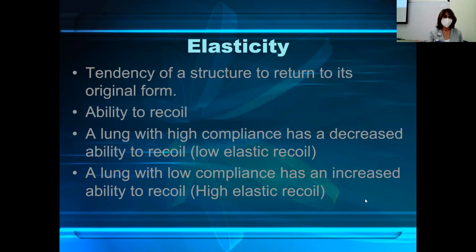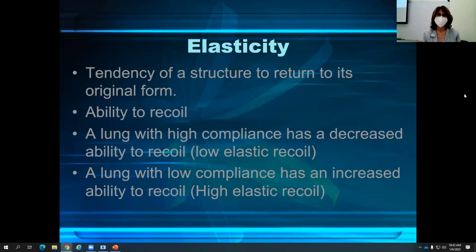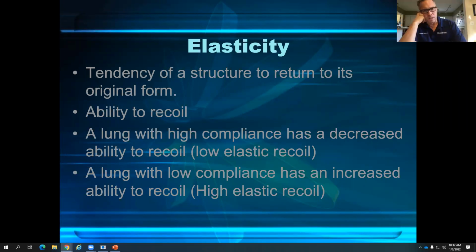So these people with high compliance, elasticity has an inverse relationship to compliance.